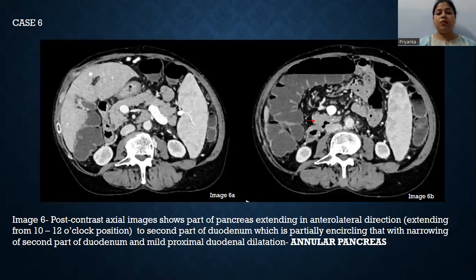Case number six shows post-contrast axial images demonstrating part of the pancreas extending in the anterolateral direction to the second part of the duodenum, partially encircling it with narrowing of the second part of the duodenum and mild proximal duodenal dilatation. These findings are suggestive of annular pancreas, a developmental anomaly.